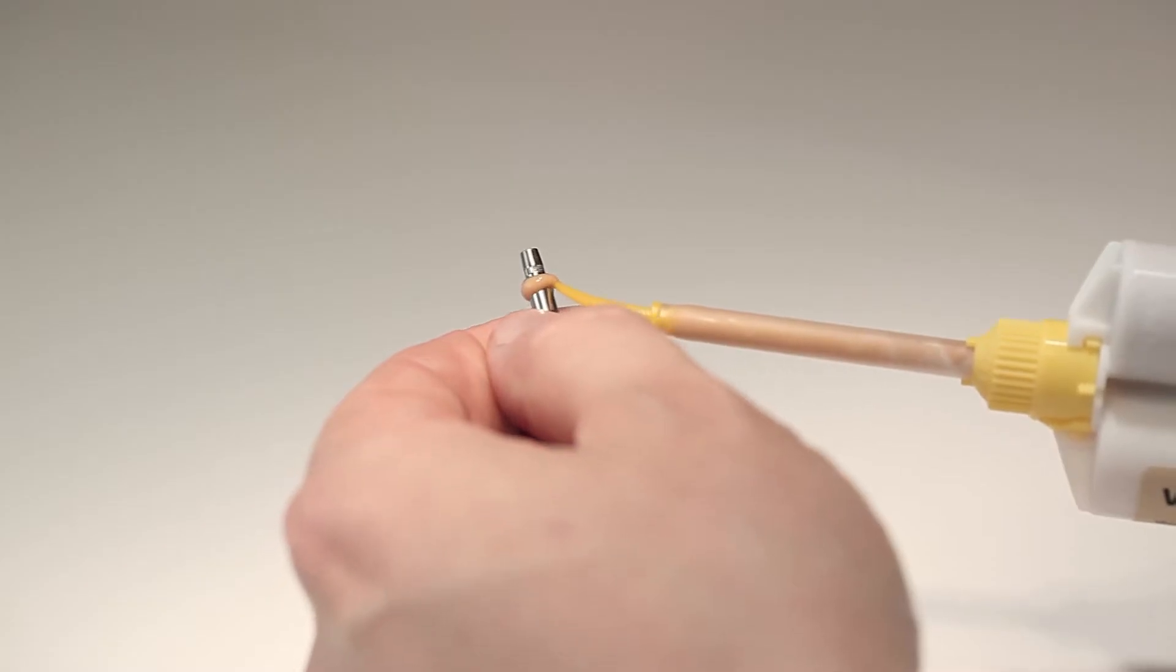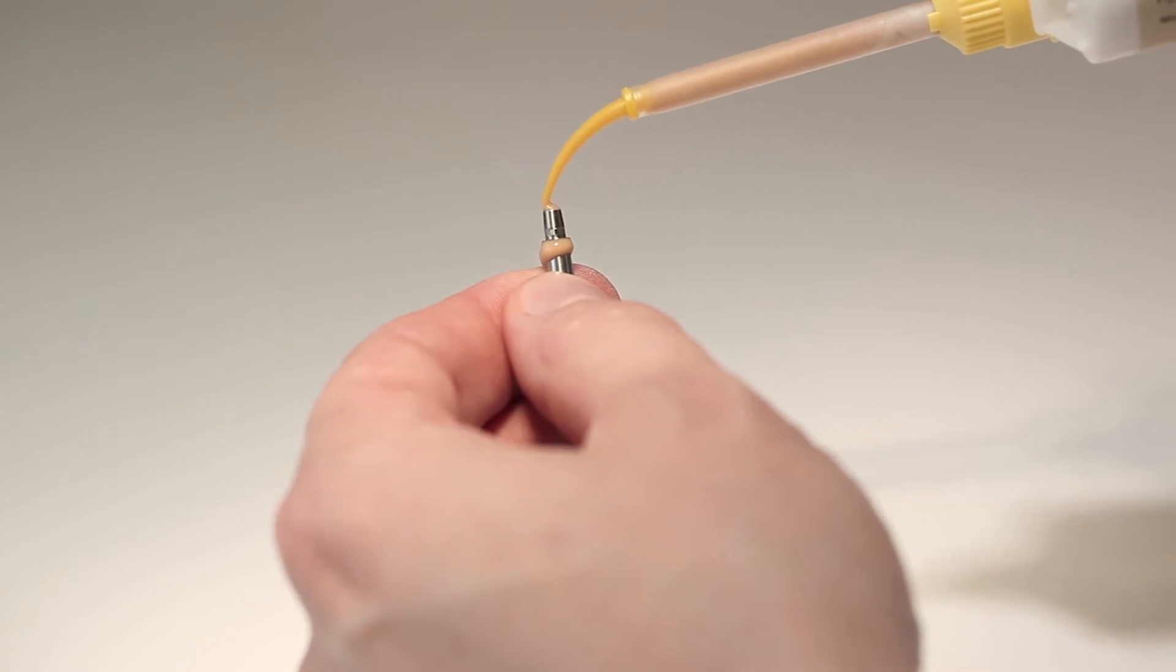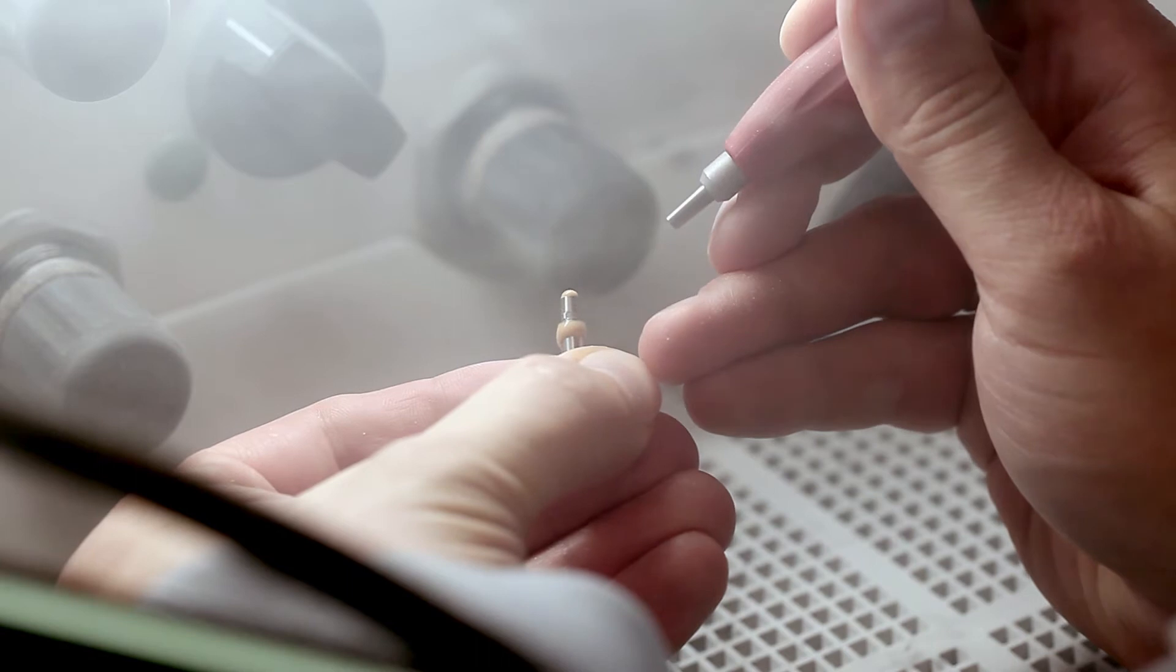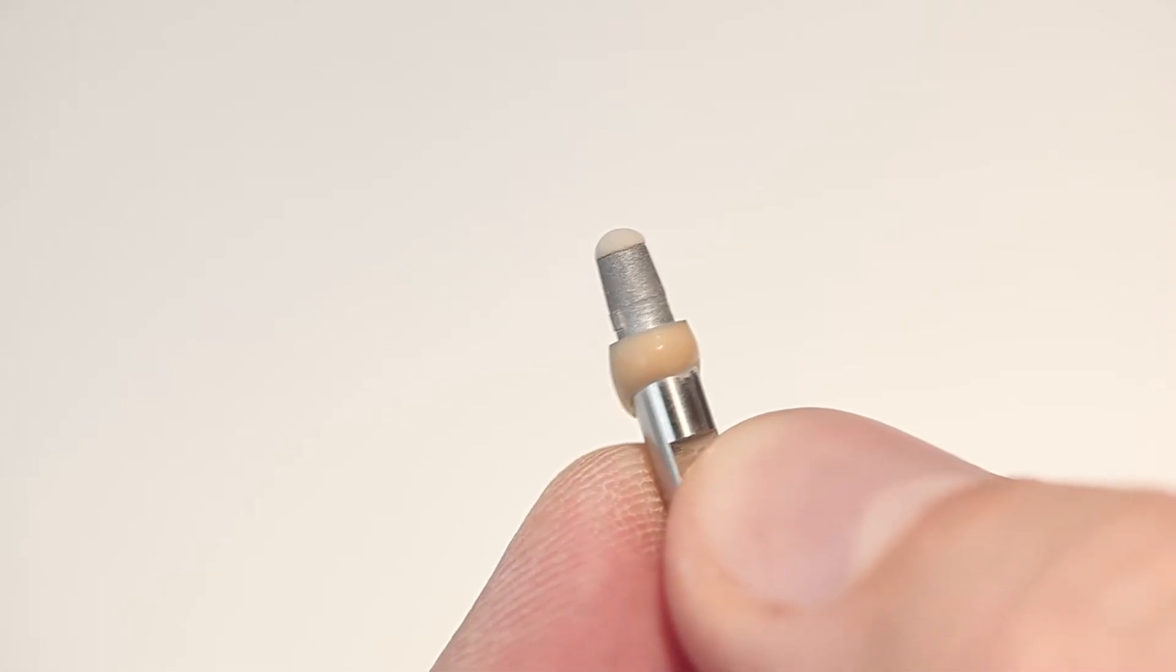The bonding surface of the tie base must be conditioned before cementation. Apply some silicone or wax to protect the emergence profile and screw channel. Blast the bonding surface of the tie base with aluminium oxide. Observe the instructions of the tie base manufacturer.